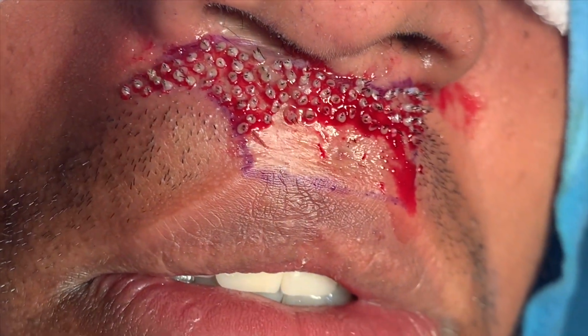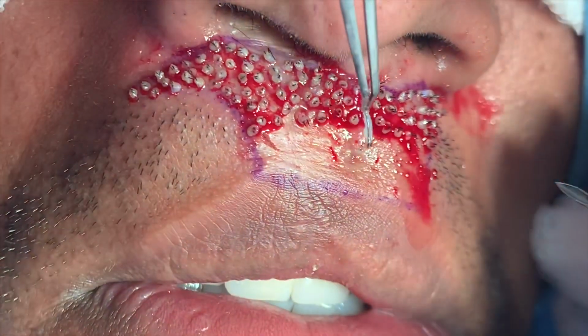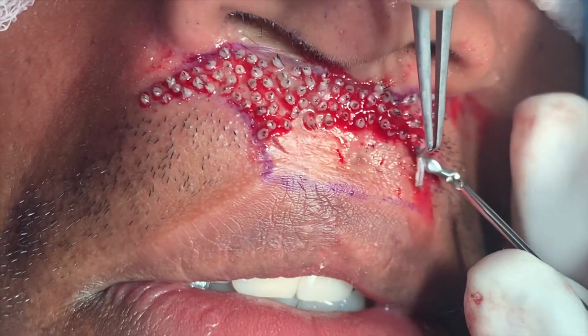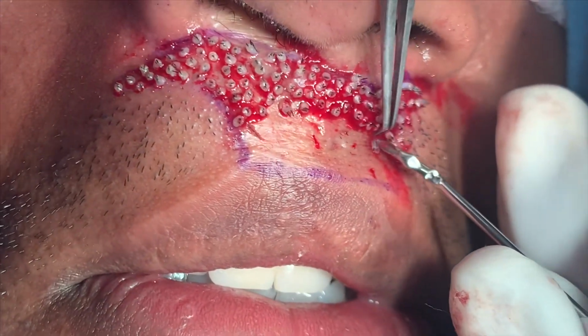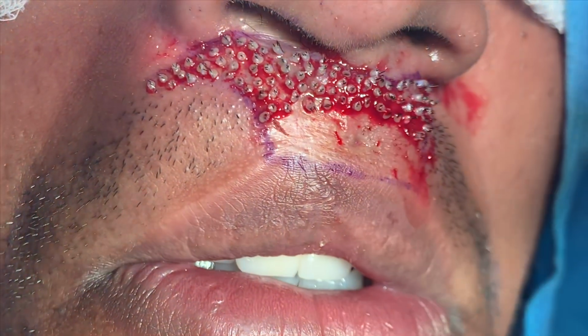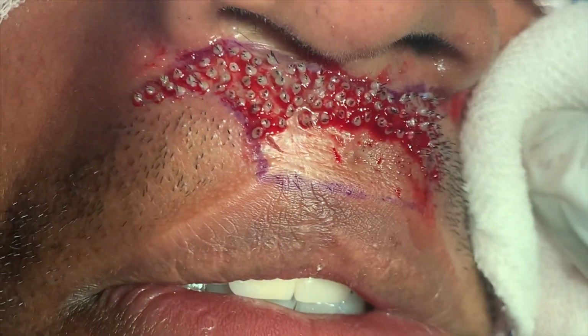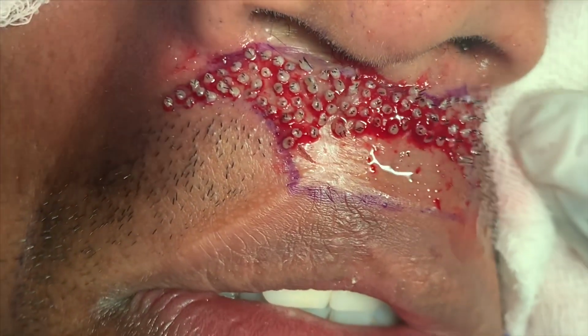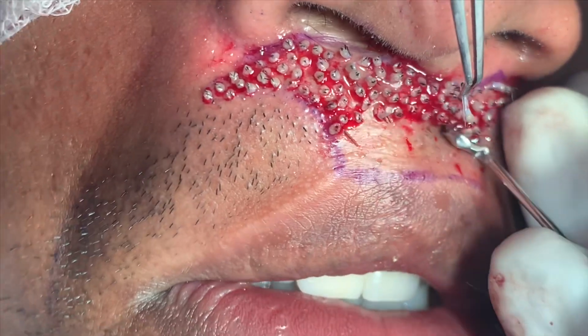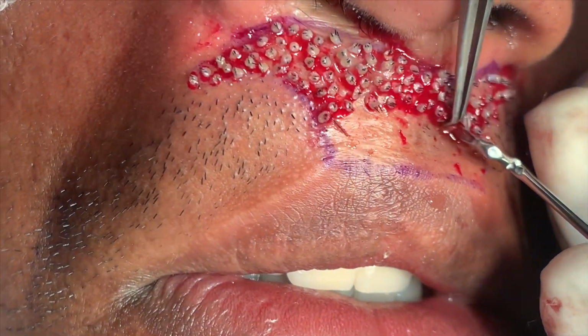So you can't have it more densely packed because these follicles that we are transplanting also need vascularity. And also with the lip, what happens is if you put it very close, when you put the next one, the earlier follicle tends to pop out. So it's a thin line between thick density to what you would want to actually take.